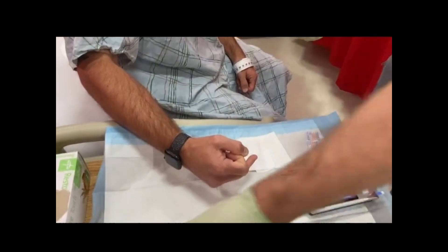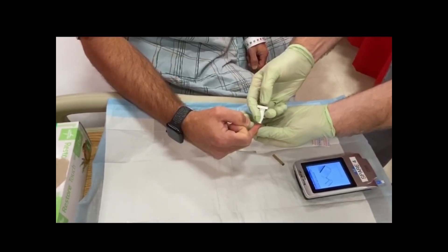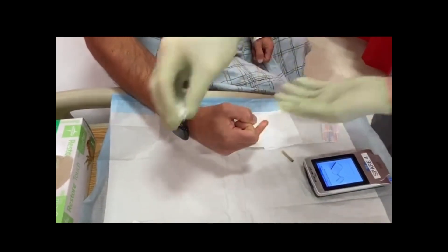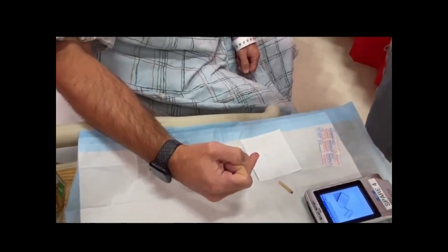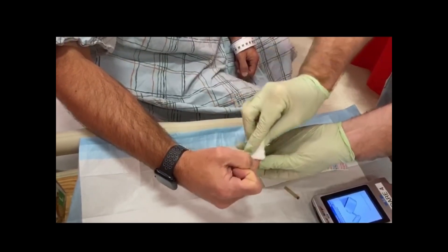Cleanse the skin site with alcohol, then place the used alcohol pad onto the dirty field. Wipe away the first drop of blood, then place the used gauze onto the dirty field.